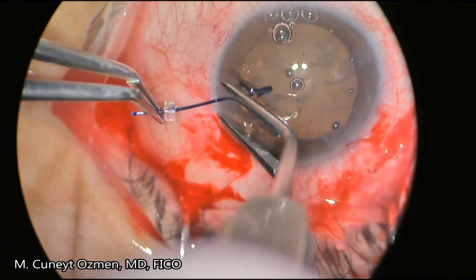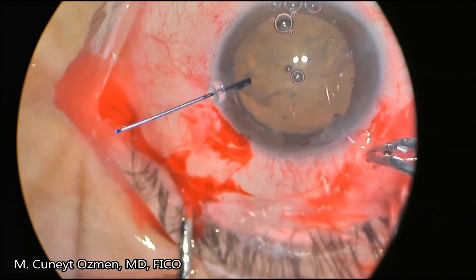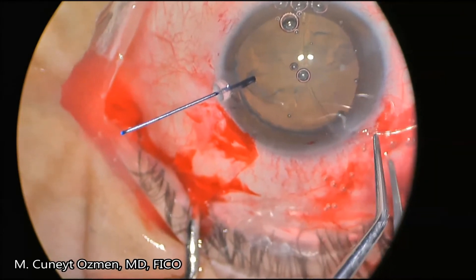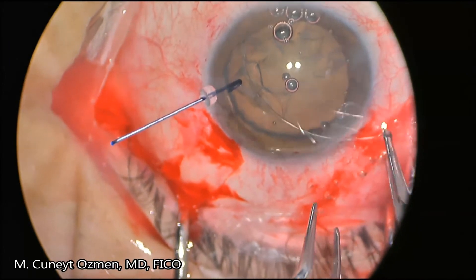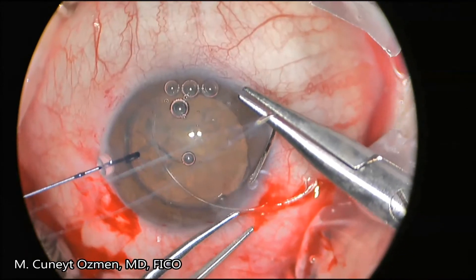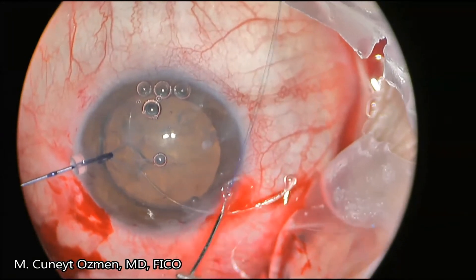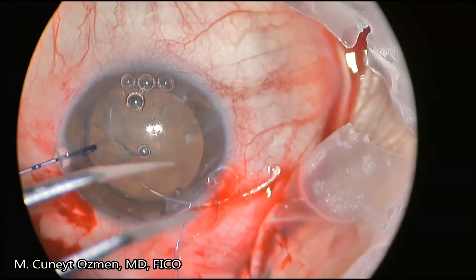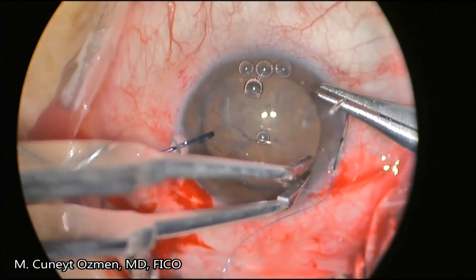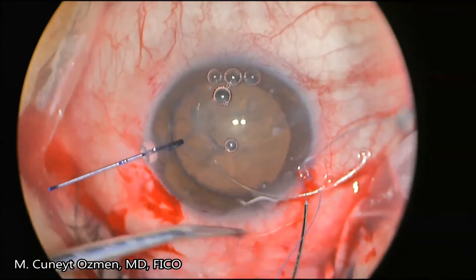For this reason, we are inserting an iris hook to support the anterior capsule, and then we have planned a Cionni ring to go forward. We are inserting the Cionni ring into the capsular bag and suturing the hook with two PC-9 sutures. We're going to use these sutures to secure the Cionni ring through the Hoffman pocket.